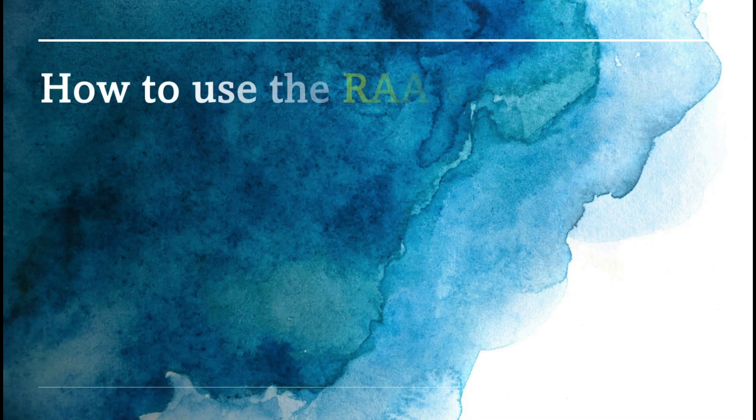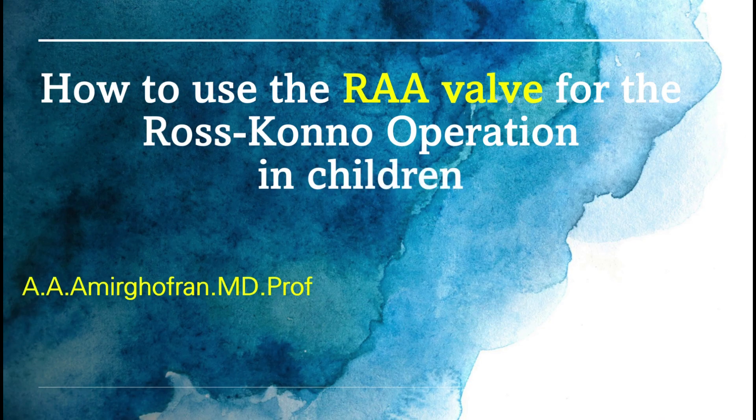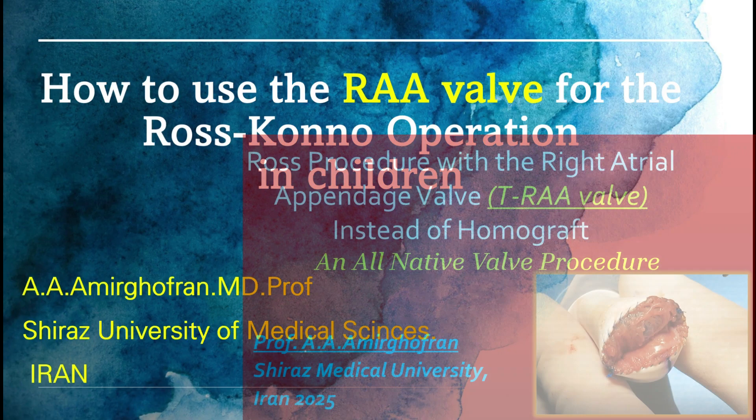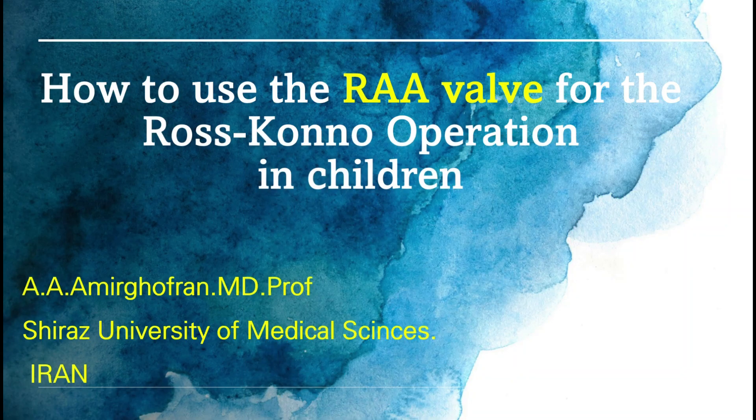How to use the RAA valve for the Roskonno operation in children. Today we will demonstrate how to utilize the right atrial appendage valve as an alternative to homograft for RVPA connection in the Roskonno procedure. We have previously shown the procedure in older children and adults, and this video shows how to do it in small children because it has to be different for preserving growth potential in these patients.